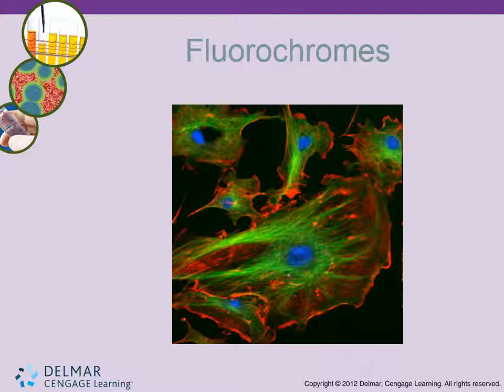Here's an example of fluorescent testing. We can attach these fluorescence compounds to the sample, and they help us to differentiate cells. Actually, this type of analyzer can do immunophenotyping. It can do white blood cell differentiation and counting. It can do reticulocyte counting and also DNA analysis.